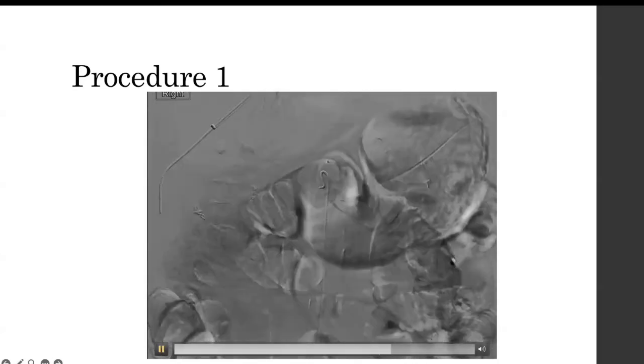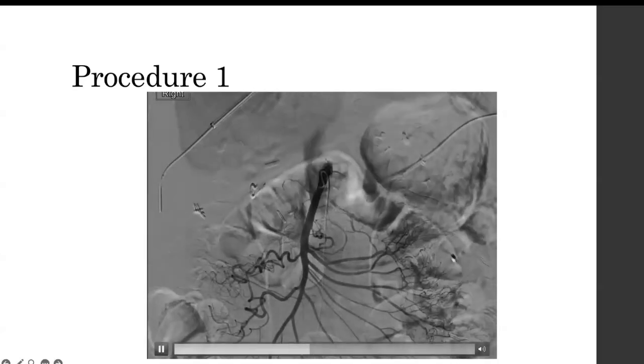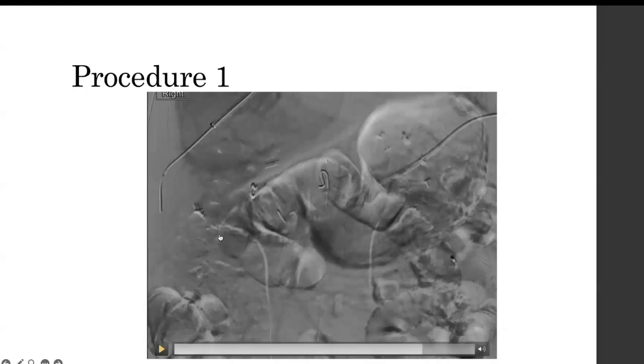Maybe I can. No, not well. Okay. So we inject it into the artery, the contrast goes through the bowel and then comes through the vein. And it's hard to tell, but here there's this abnormal remnant of the portal vein. It's not the portal vein. It's just some dilated collateral.